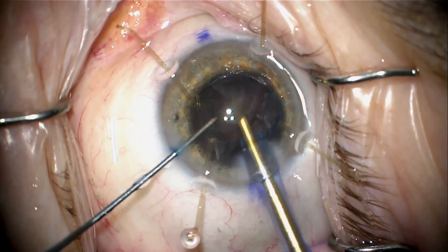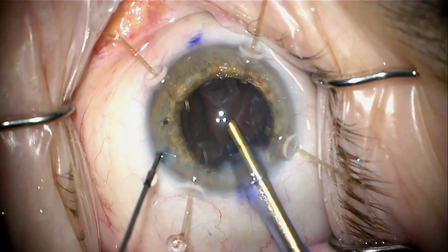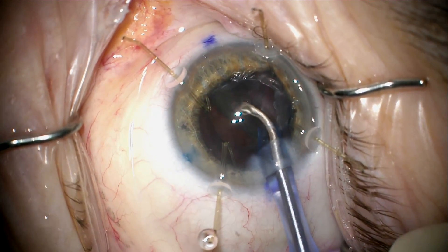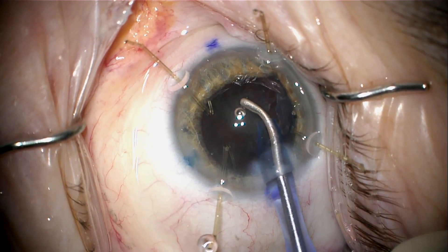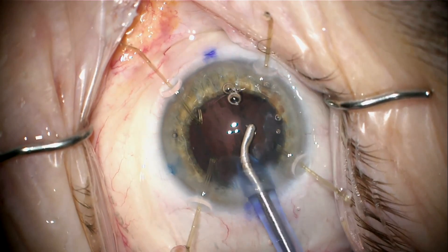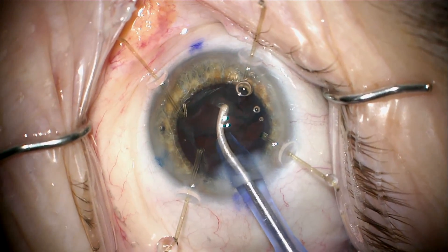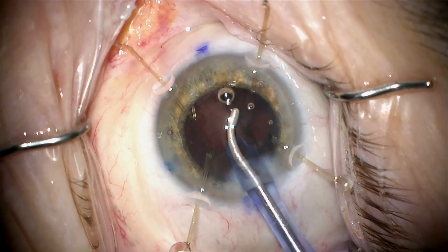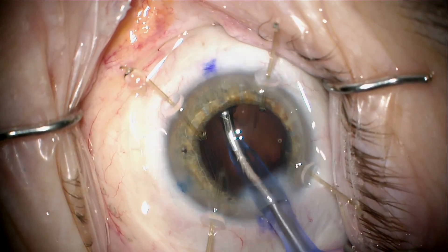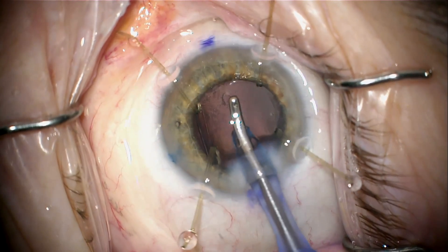There is a bit of an epinuclear cortical shell that I'm going to remove with the I/A. Just bring this out of the capsular bag centrally and aspirate it. Even though this was a very dense cataract, there was a thick cortical shell because this was a post-vitrectomy cataract with a very dense central nucleus, and the periphery was not quite as hard — which is one of the reasons I chose to do the type of chopping technique that I did here.